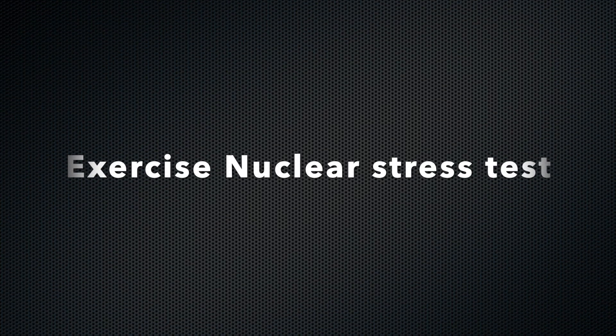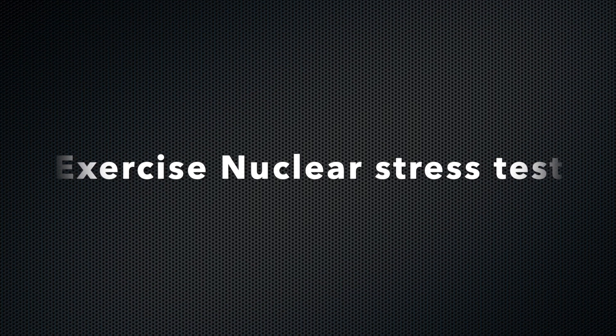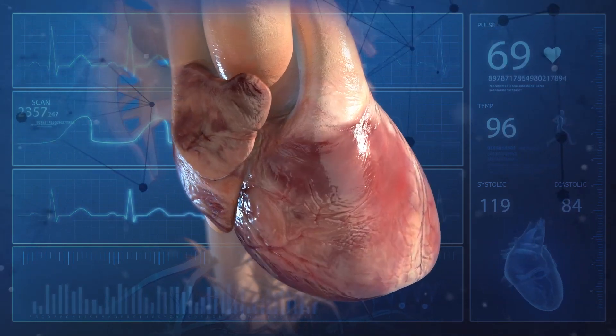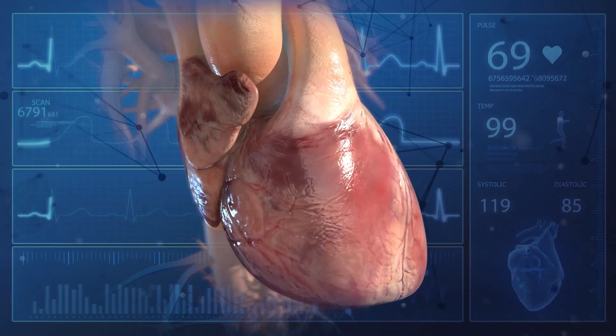Hello, today your doctor has asked you to complete a treadmill stress test. In this video we will guide you through the process of the testing. This test will provide your doctor with valuable information about your exercise performance, symptoms, and some heart functions with exercise.